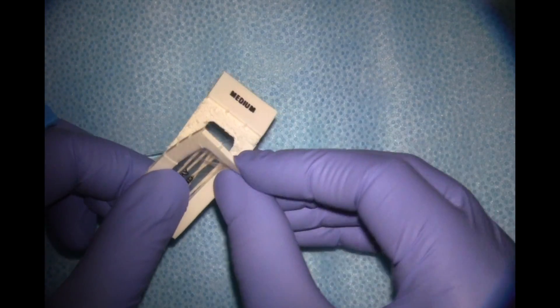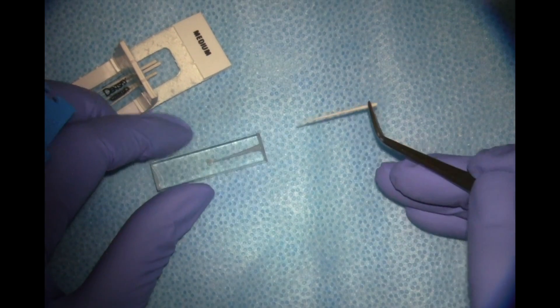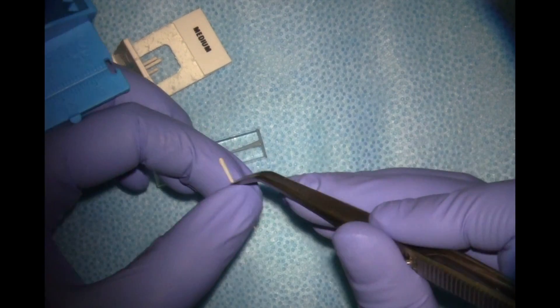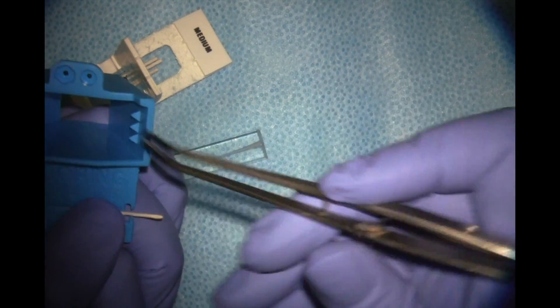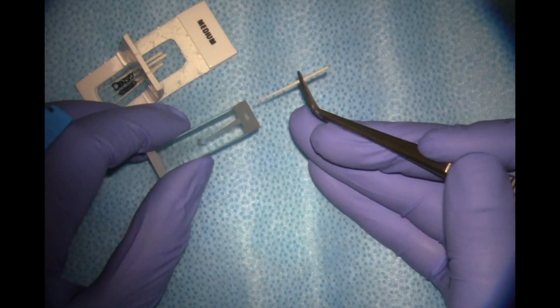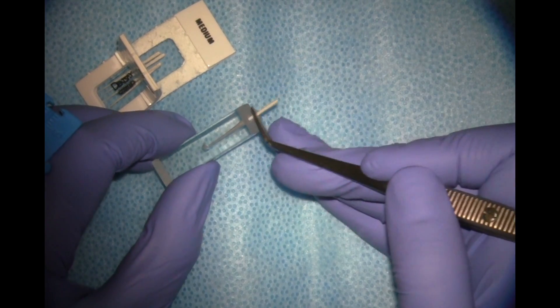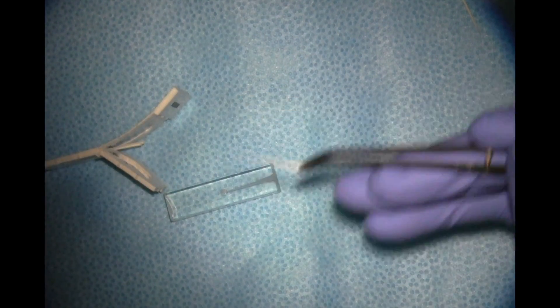These are medium paper points — they come in different sizes: fine, medium, and coarse — and medium works for most canals. We can always measure our paper points so they're not pushed beyond the apex and possibly create apical inflammation. I'm going to measure them at my working length of 16 and dry out the canal of any moisture to create a good seal. We'll use a few points to dry out at the end of cleaning and shaping before we obturate.